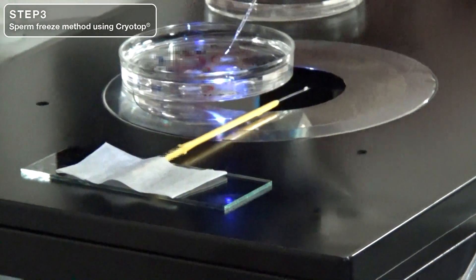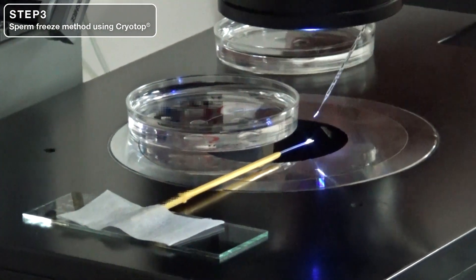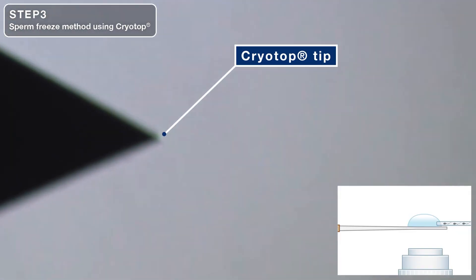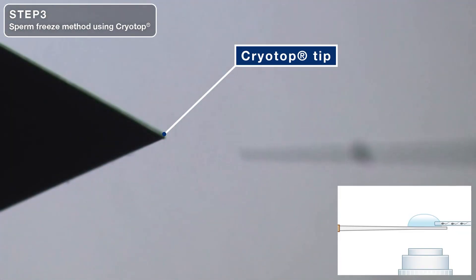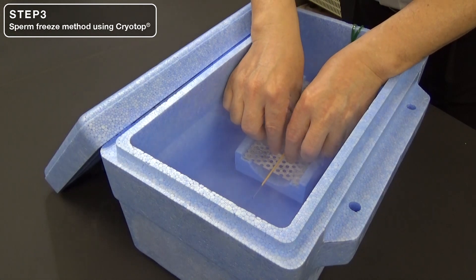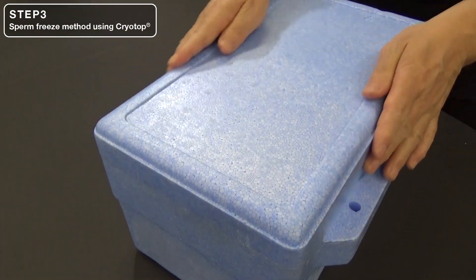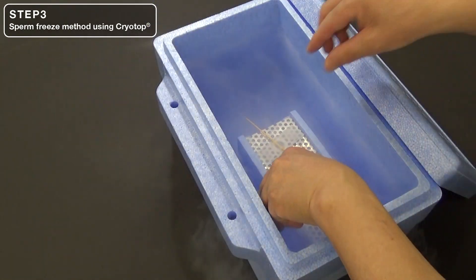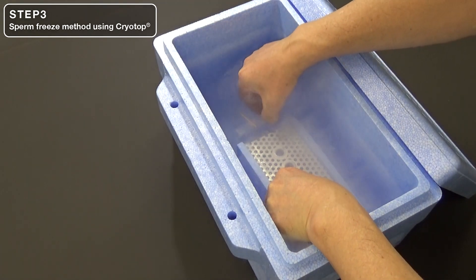Adjust the stage to align the pipette with the CryoTop. Be careful not to allow the freeze solution on the CryoTop to evaporate. Slide the stage and quickly inject the sperm into the freeze solution. Put the specimen on a float or sperm freeze board on liquid nitrogen and cover its container with a lid. Expose the tip of the CryoTop in the vapor of liquid nitrogen at minus 105 degrees Celsius for 2 minutes to freeze it. The sperm freeze board keeps the CryoTop 2 cm above the surface of liquid nitrogen and stabilizes the temperature to cool specimens. After 2 minutes, plunge the CryoTop into liquid nitrogen at minus 196 degrees Celsius.